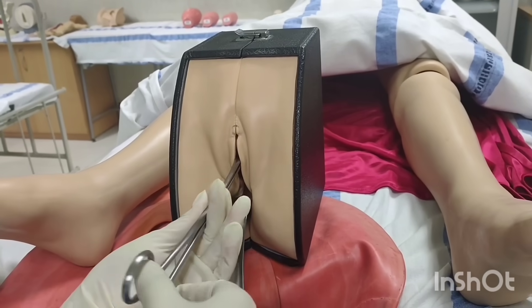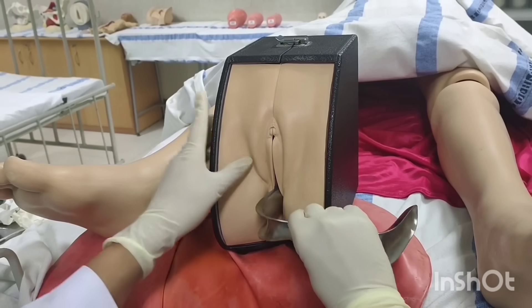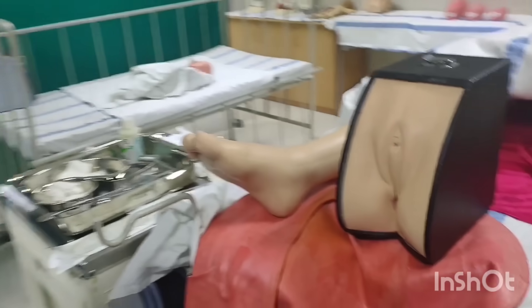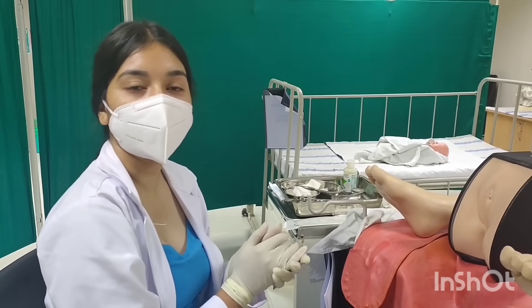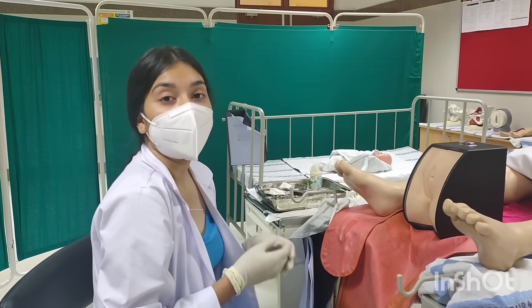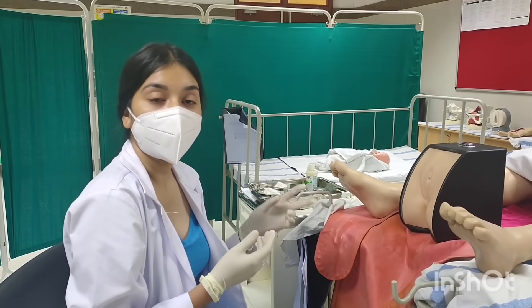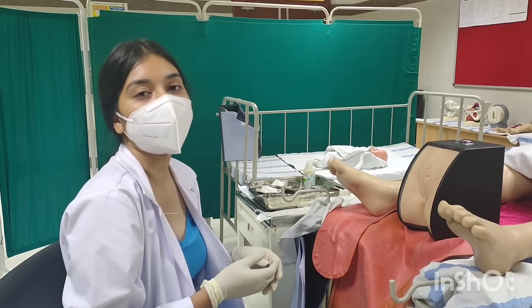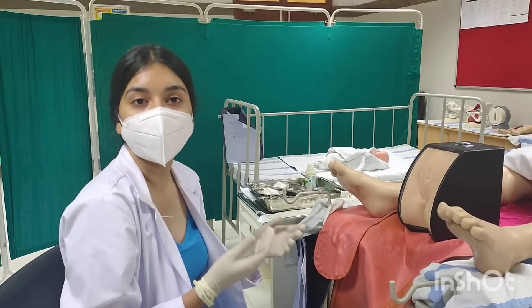Remove the valsellum and remove the speculum. Place the patient in a comfortable position and the procedure is over. You can discard all the articles and wash your hands. Note: if the thread is too long — more than 2–3 cm — you have to cut the thread. Assure the mother that light spotting is normal. If there is more than that, she can talk to the doctor.